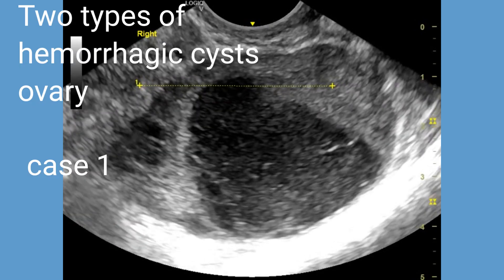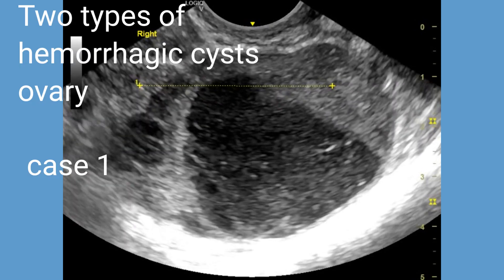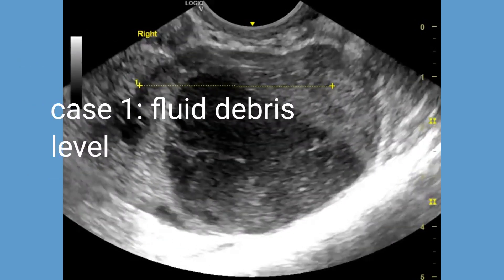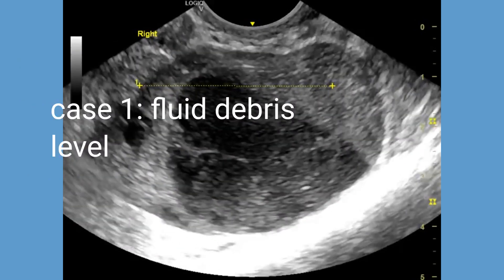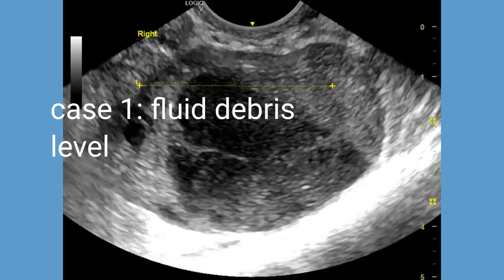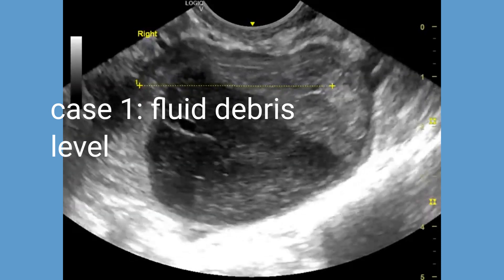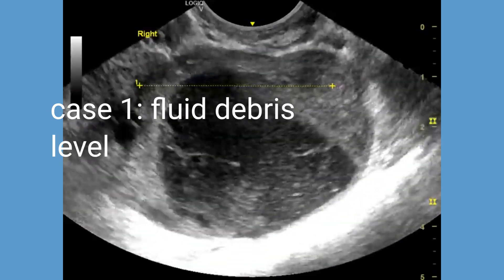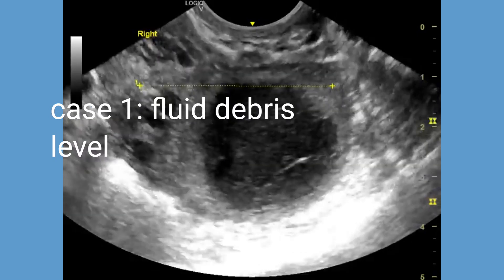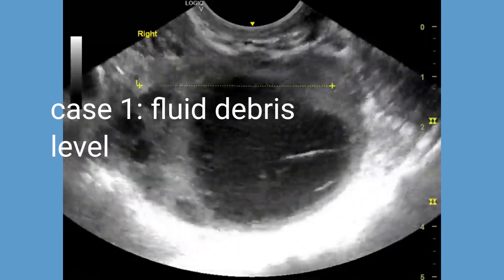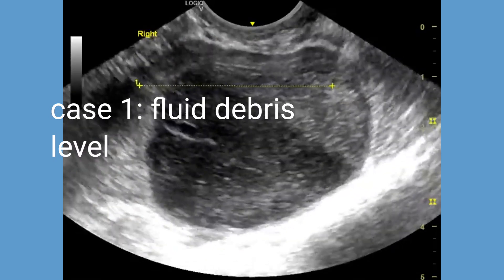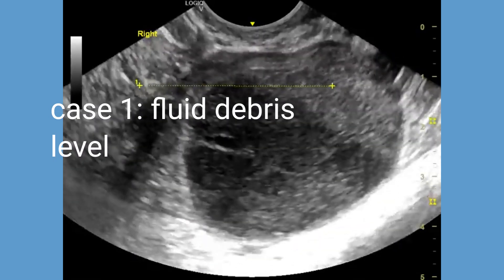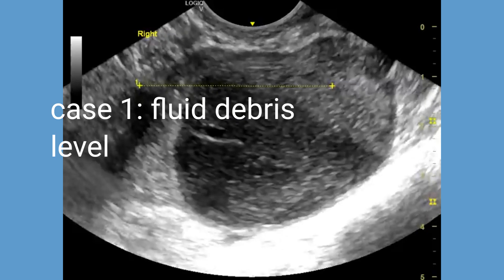This cyst shows the fluid debris level in a hemorrhagic cyst, which refers to the layering of different materials within the cyst. Typically, there is a separation of the more echogenic or brighter debris towards the bottom of the cyst and the less echogenic, darker fluid above it.